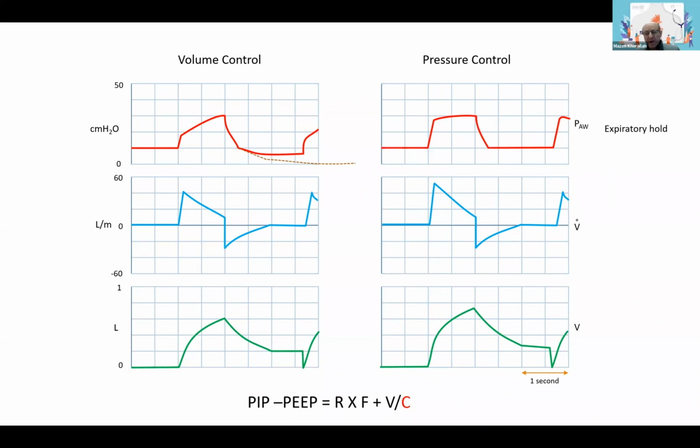And if you have air leak in the system, what does it mean? It means that the compliance is improved. Okay, you have a hole, you can easily push air through it. This is the opposite of decreased compliance in a patient where you have a pneumothorax, for example. You have a leak, but you're not leaking outside the chest, so you put pressure on the chest.